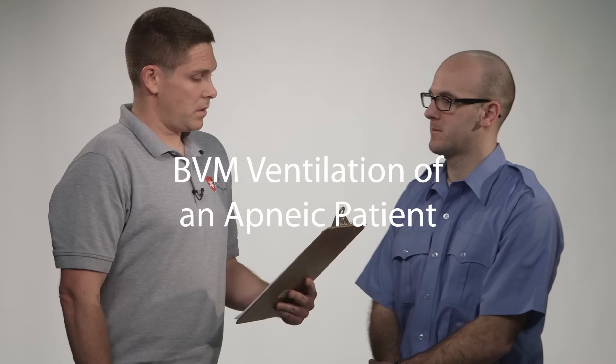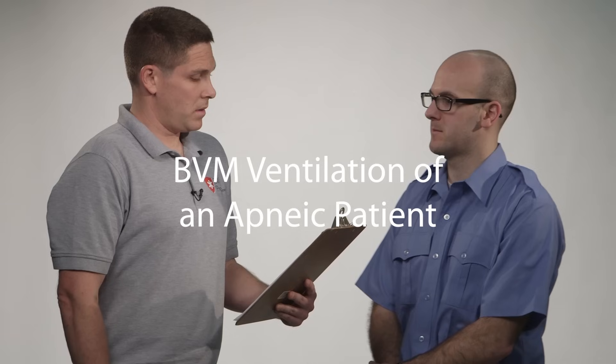Let's watch in real time as the candidate performs the necessary steps for bag valve mask ventilation of an apneic patient. This skill is designed to evaluate your ability to provide immediate and aggressive ventilatory assistance to an apneic adult patient who has no other associated injuries. This is a non-trauma situation and cervical precautions are not necessary. You are required to demonstrate sequentially all procedures: simple maneuvers, suctioning, adjuncts, and ventilation with a BVM.